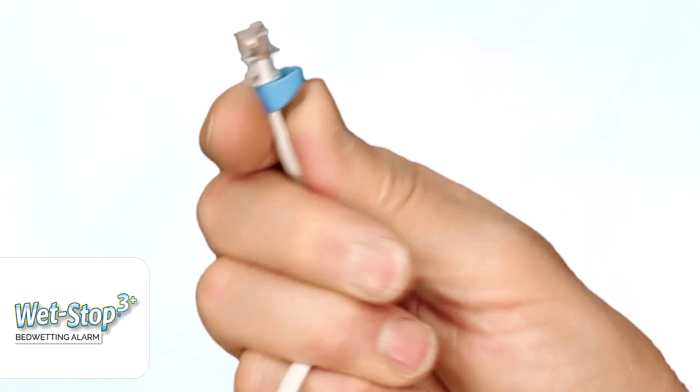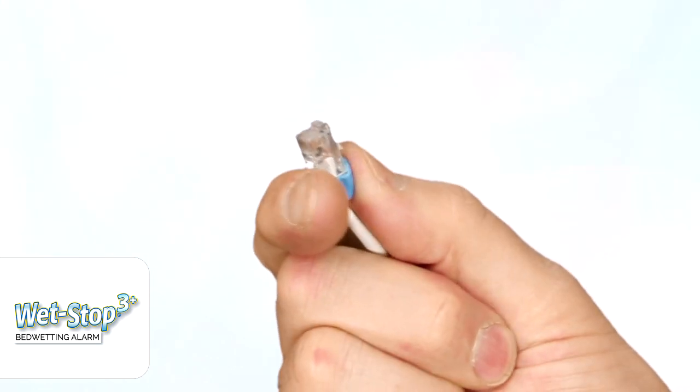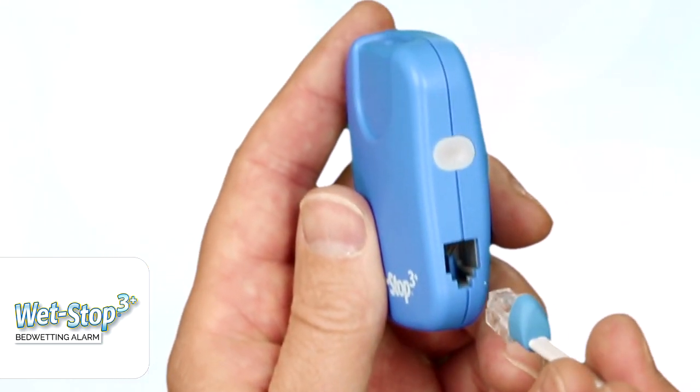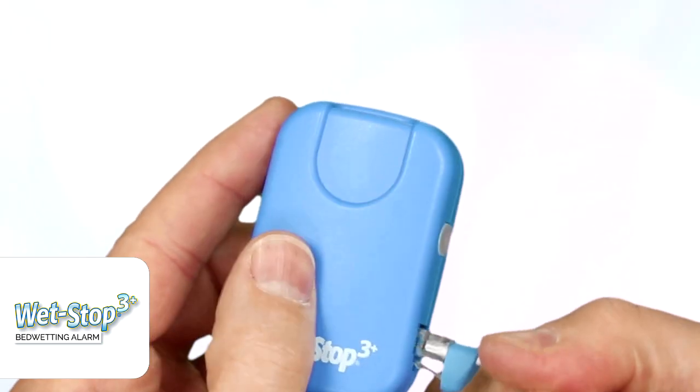On one end of this sensor, you'll see something almost like a telephone jack, and that clips into the side of the alarm here, as you can see. This little blue tab is to help protect the plastic part of that clip so it doesn't break.